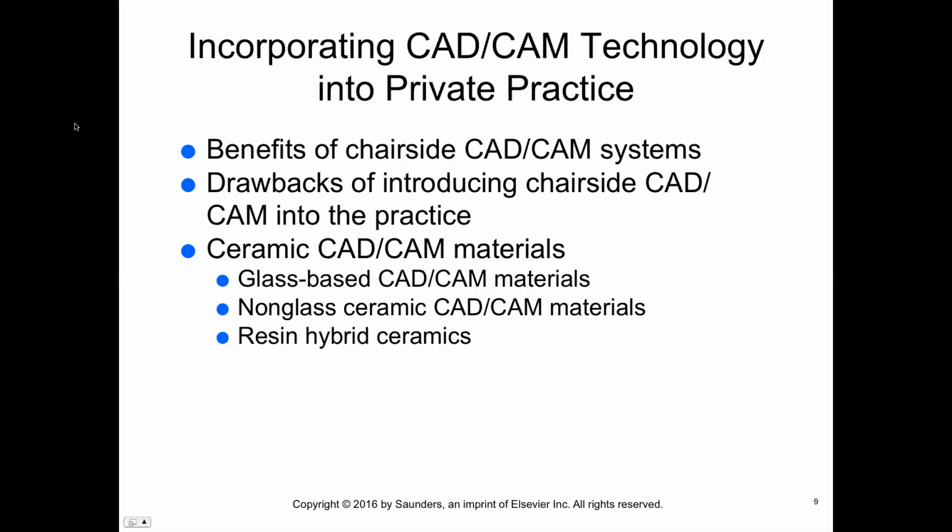As a hygienist, the dentist can delegate specific duties to his team members who have undergone training. The dentist may want you to take a training course geared specifically for you, and you will be capable of using the scanner to capture images of prepped and adjacent teeth along with the opposing occlusion. You'll learn how to mark the location of the margins and design the restoration, and also initiate the milling process if you have a milling machine on site.